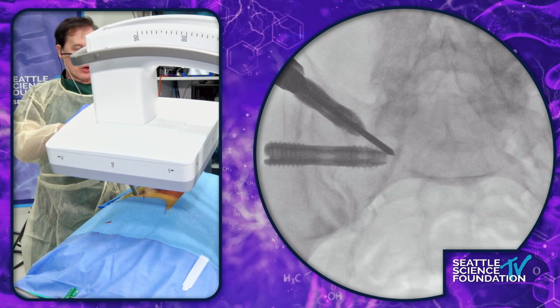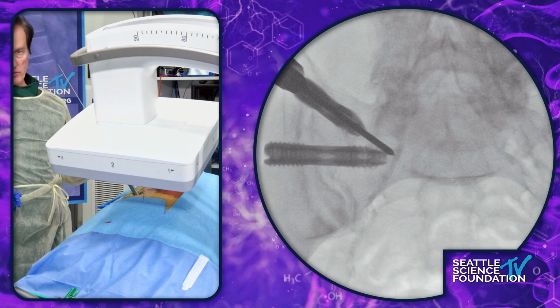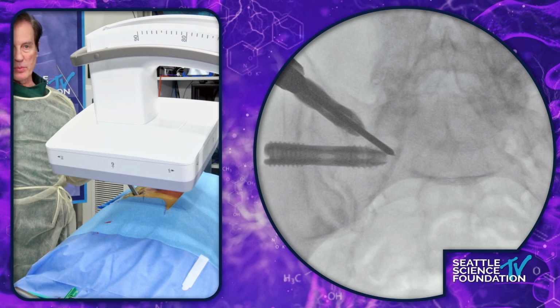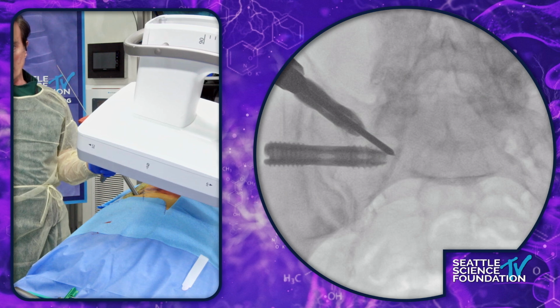And so let's arc 15 degrees toward you. I'm going to stop short of that. You can see why I sized this, because this would run into the other laterally placed implant. But otherwise, we'd have a longer screw.